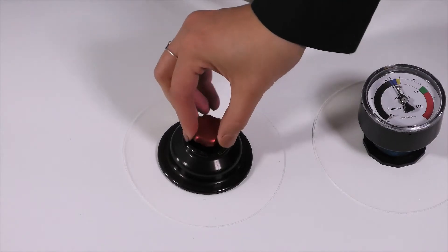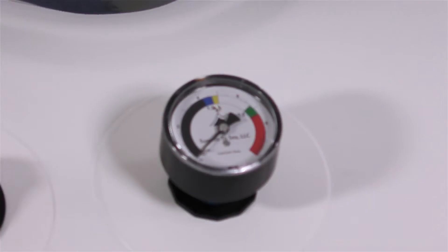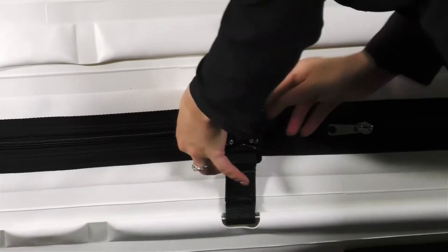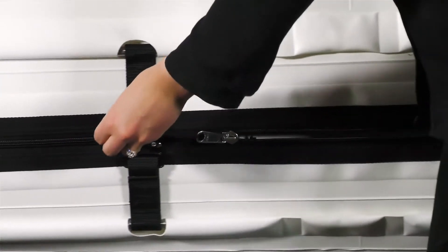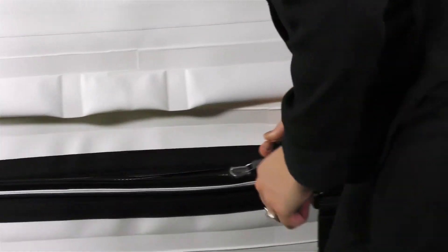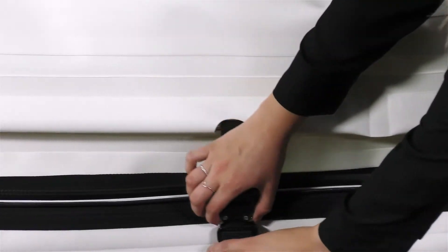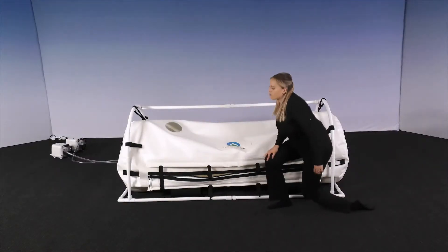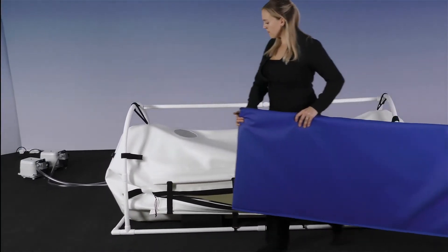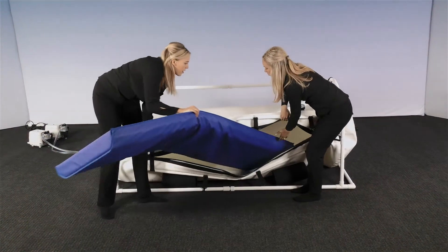Now you can deflate the chamber by turning the red deflation valve. It is designed to turn in either direction to release air from the chamber. As you turn the knob, you will notice that you have control of the speed of deflation. When the gauge reads zero, you can unzip the external and internal zippers, then unbuckle the belts, pushing the gold levers towards the opposite side. Now that the chamber is deflated and attached to the frame, it is time to slide the foam mat inside the chamber.